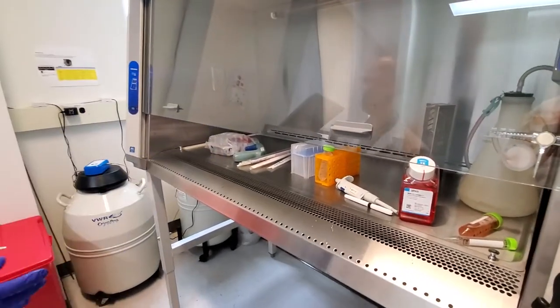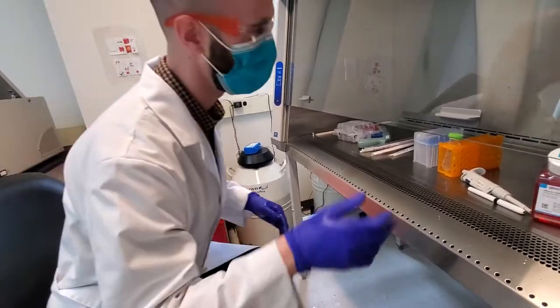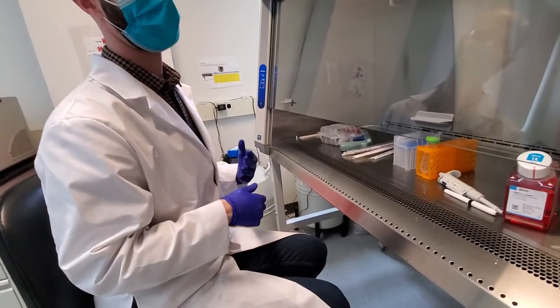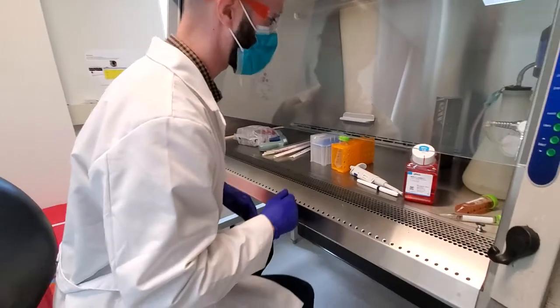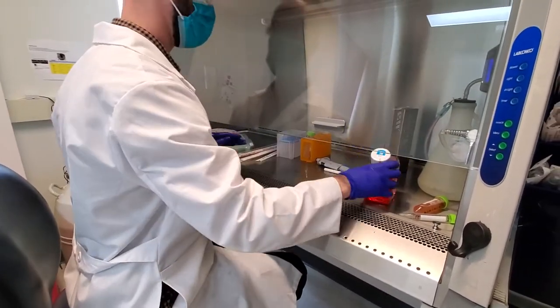You don't want to use the same gloves you used for chemicals in the synthesis room to do tissue culture. It's good practice to keep it separate, within reason. Okay, so I'm going to make the media now.